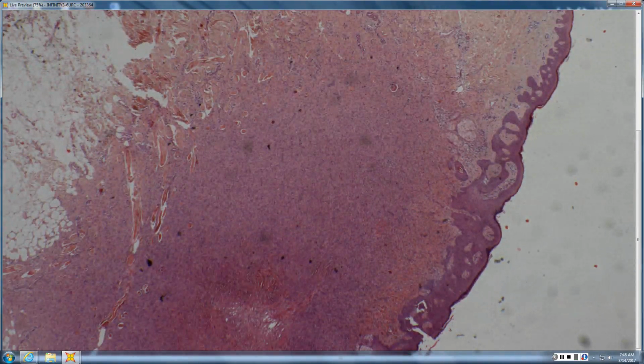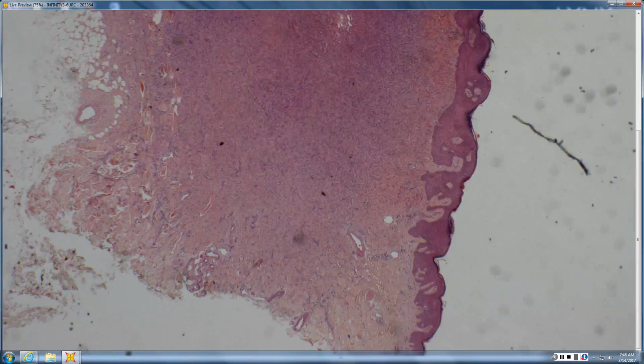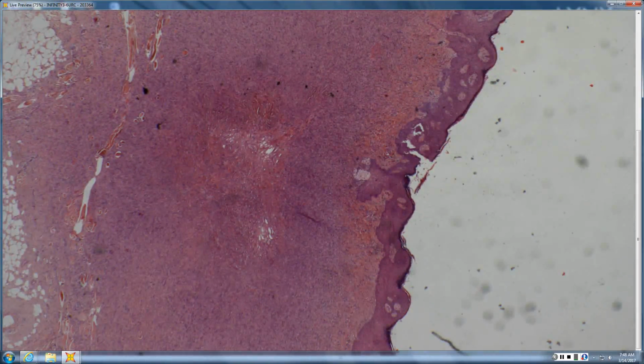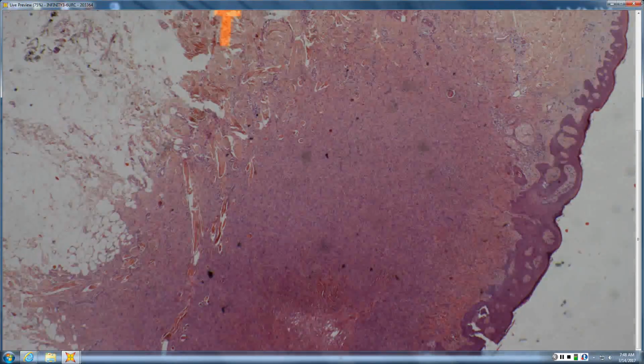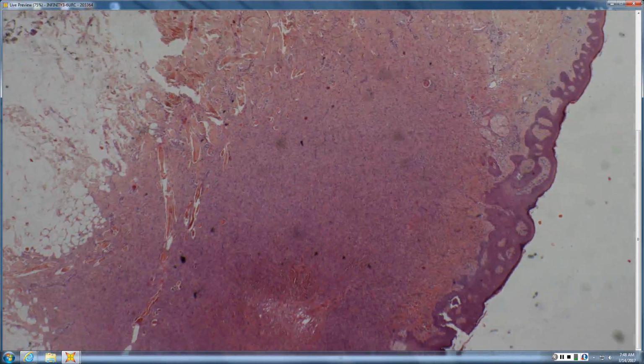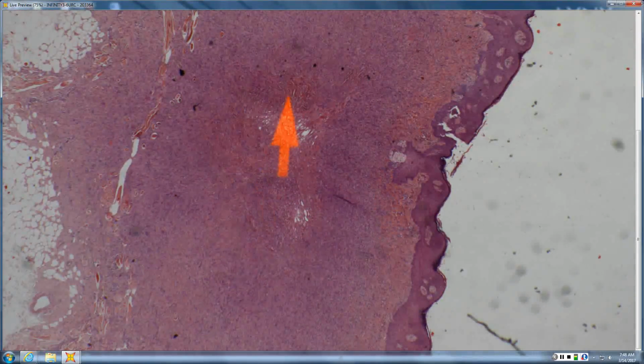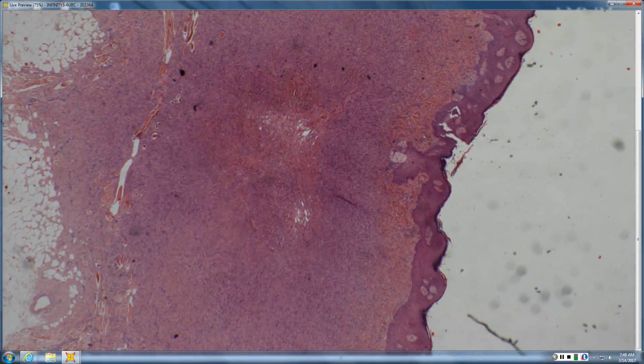Looking at it, you have a pretty large, busy dermis, some overlying acanthosis. So now the DF would have to be in the differential. You have some collagen trapping at the periphery. Yeah, you have beautiful collagen balls at the periphery that you can see at scan. You have overlying acanthosis. You have sebaceous induction. You have hypocellular and more densely cellular areas, and it goes into the fat in a lacy fashion. That's all good for DF. Very good.